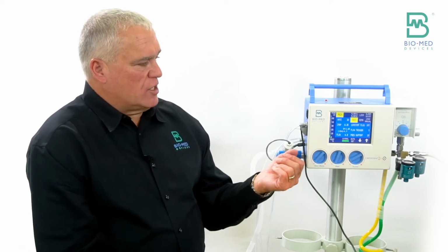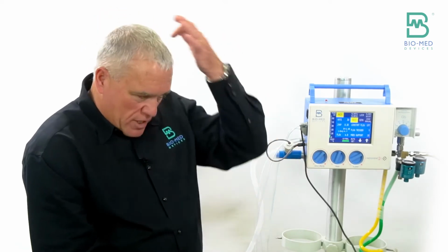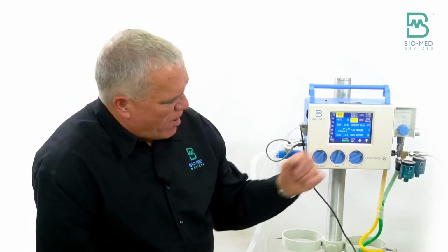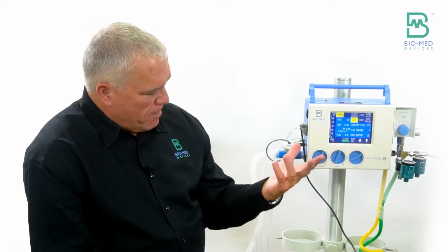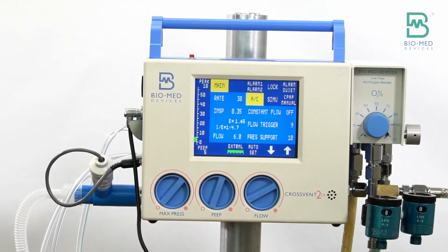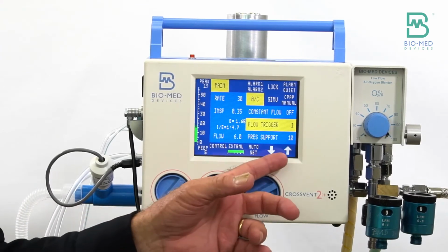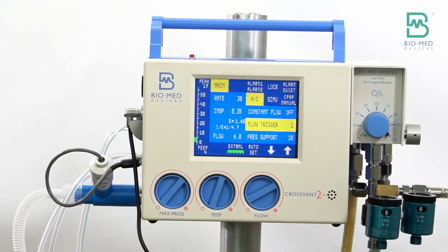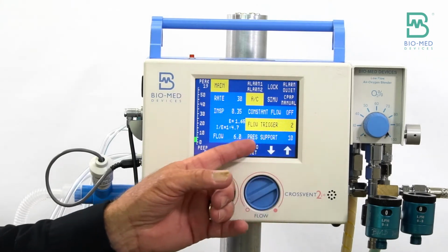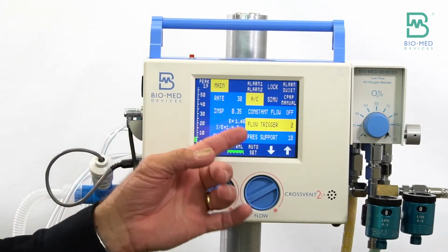Obviously, if the leak is so big that you can't even ventilate the baby, then you're going to have to change it. But you may have to go up high on your sensitivity. One of the things is we don't show leak percentage on this vent. So if I turn off this leak, if I can dial the sensitivity down to say 1, 2, or 3, you pretty much don't have a leak.